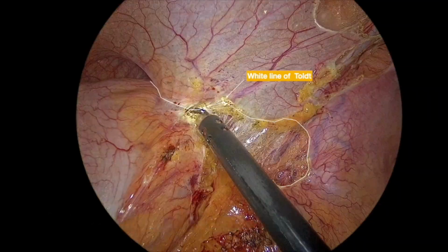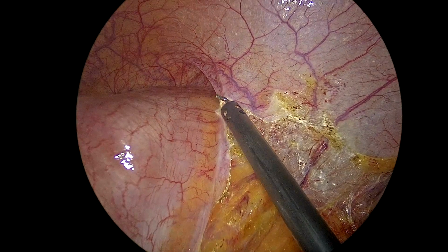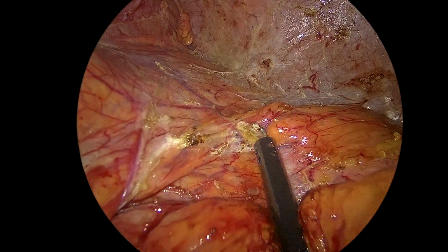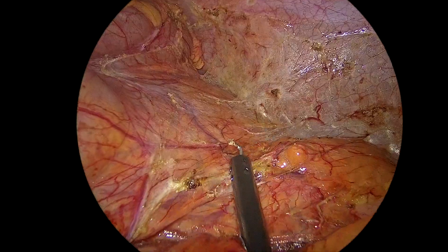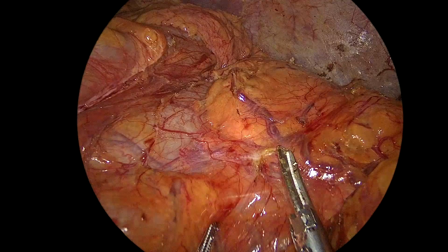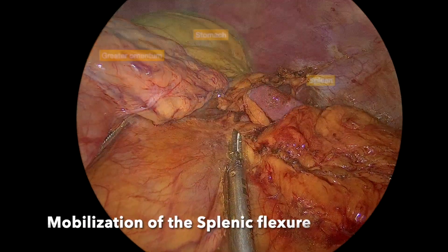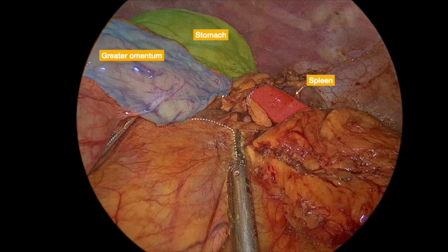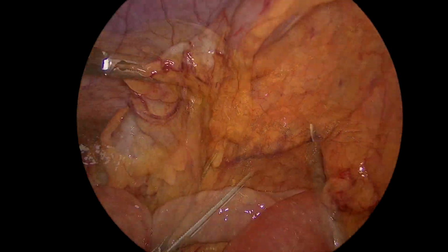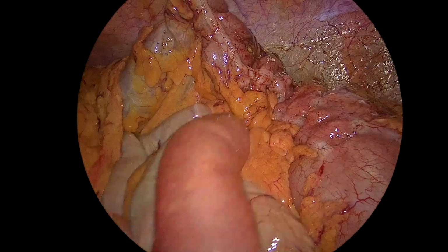First step, lateral to medial dissection. The white line of Toldt in the left paracolic gutter was incised, and dissection was in an avascular plane between the mesocolon and retroperitoneum. When dissection is extended to the splenic flexure, complete splenic flexure mobilization with an energy device, and care must be taken to avoid damage to the pancreas and spleen. Full mobilization of the descending colon and splenic flexure.